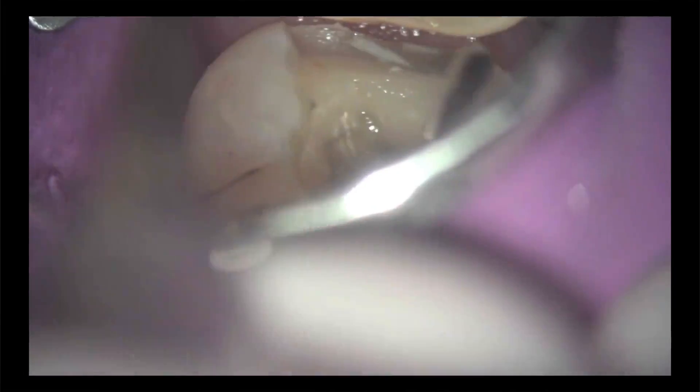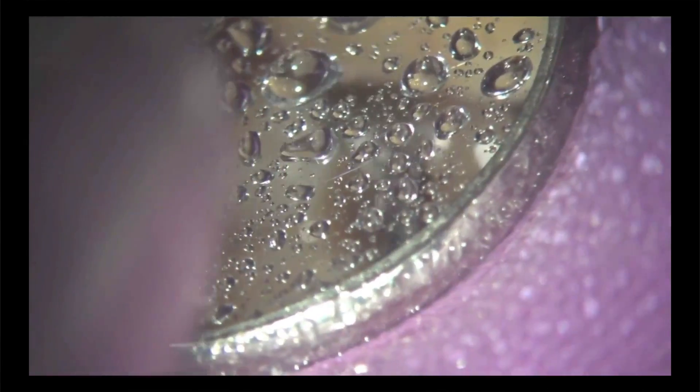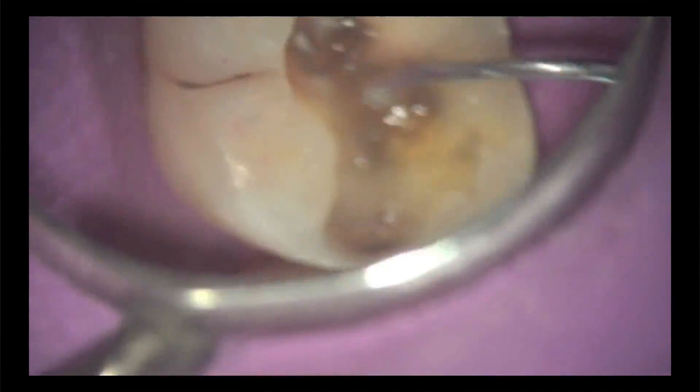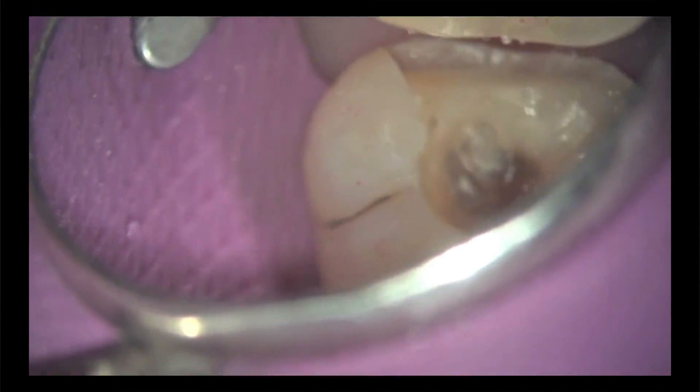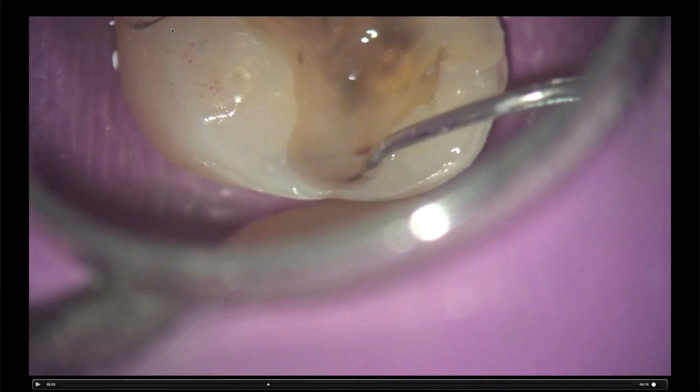So now here is a better mirror. If you look here, typically when I'm finished prepping with that instrument, there's some little ragged areas of enamel and I use a scaler, a posterior scaler. You can use an enamel chisel just to smooth the enamel margin by hand. And there I needed to extend it further palatally because there was decay on the wall. So there I've extended it. And now here's where you can see the distal margin and now I'll go to the mesial margin. So you can see here, if you can imagine the same as if you had a small slot here and then you want to prep the box form. Now I've thinned out the enamel enough that the box form can be prepped with the sonic instrument.